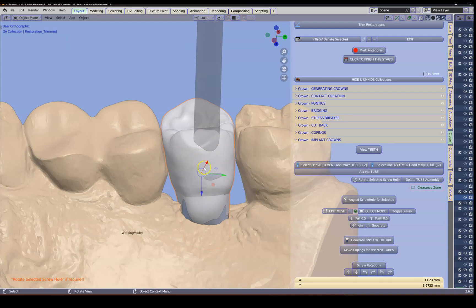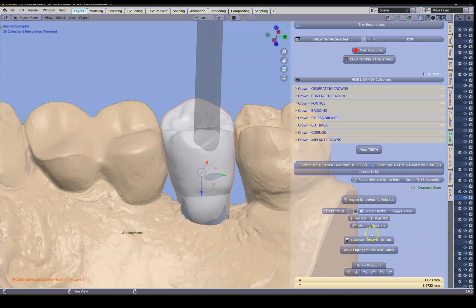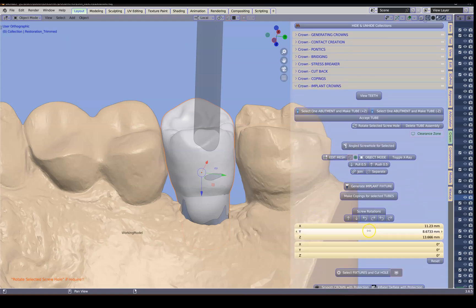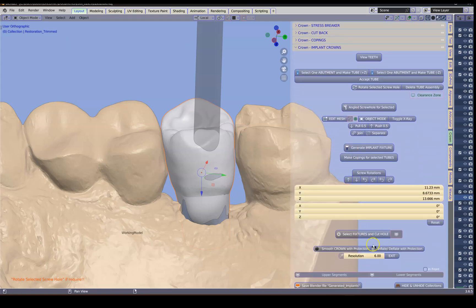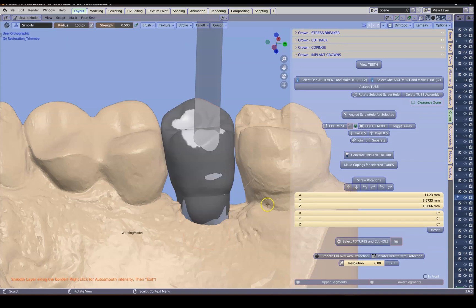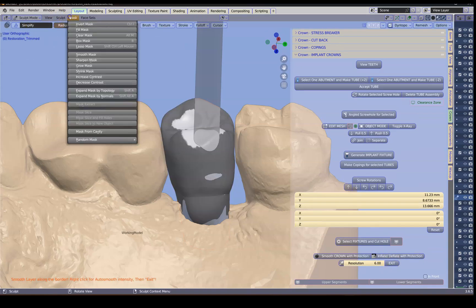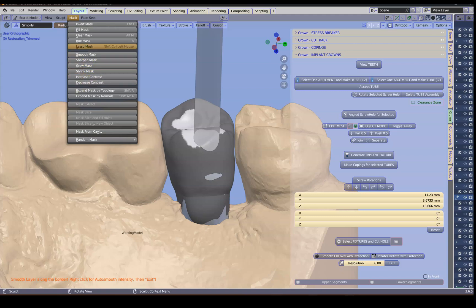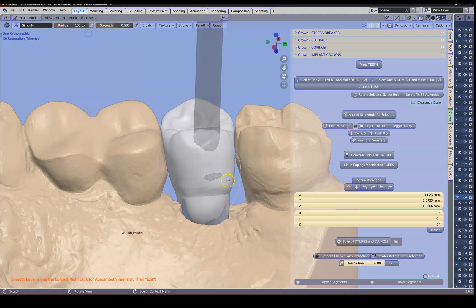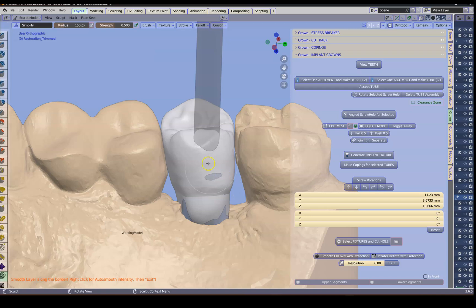We're going to go back to object mode. And now we're going to combine and connect all of them by generating this fixture. Note here we're a little bit thin as well for this screw channel. So in so doing that I can sculpt and make this a little bit bigger, thicker. We'll just remove the mask. Clear mask.